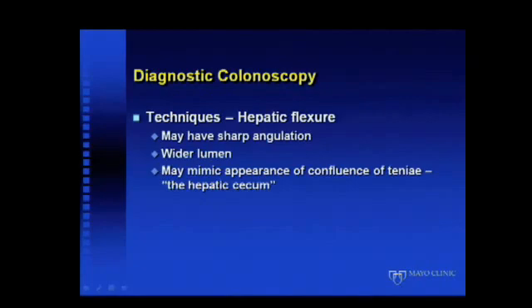At the hepatic flexure, sometimes this can actually be more angulated and more difficult to get around than even the splenic flexure. A distinguishing feature is that one starts noticing a wider lumen. Occasionally where the folds overlap, it may have the appearance of the confluence of taeniae, and people may think they're at the cecum when they're actually not. I teach residents and fellows: if you only think you're at the cecum, you're not — you're at the hepatic flexure, which doesn't count.